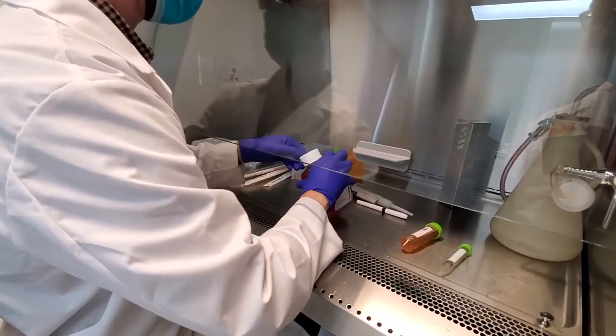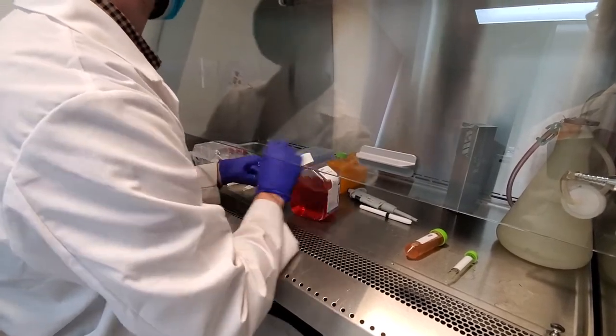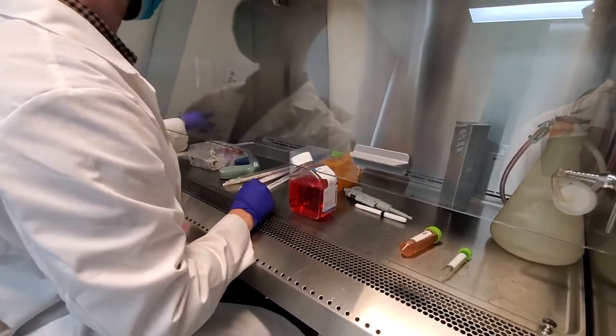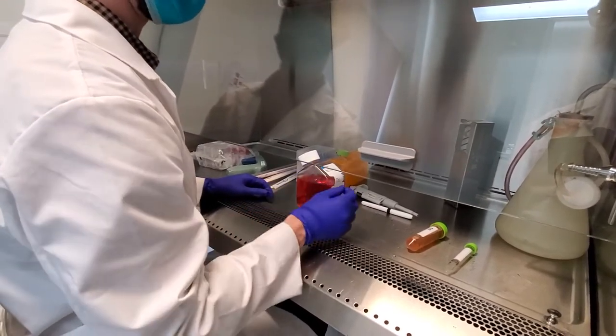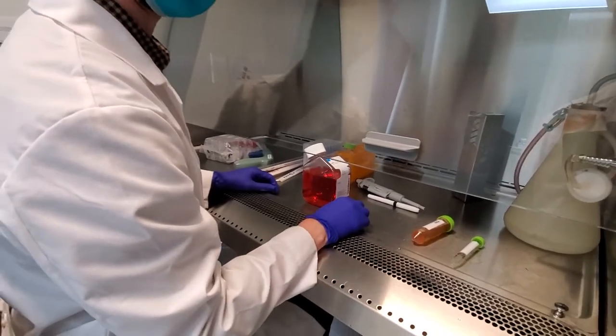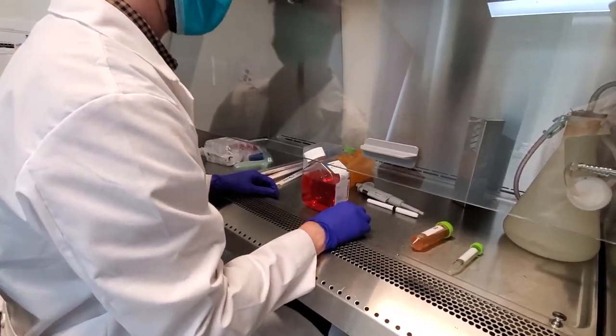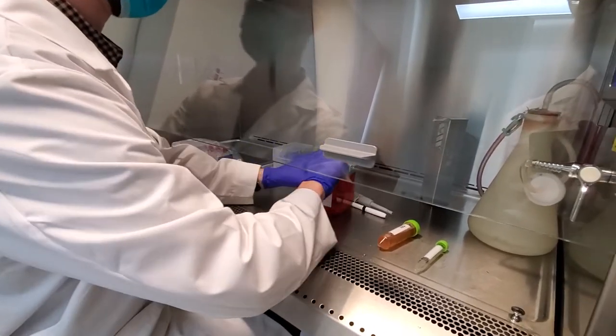If something happens to the media and you're not sure it's in good shape, you may be concerned that it got contaminated. We have big vacuum filter flasks where you hook it up and pour the media through a sub-micron filter. But usually you just keep things in the bottle here. All right.